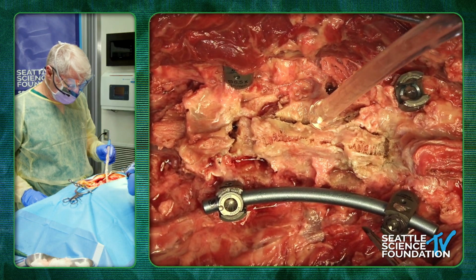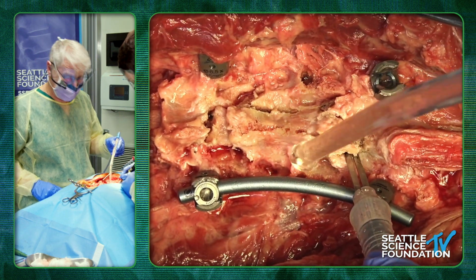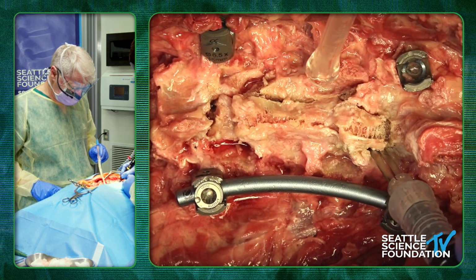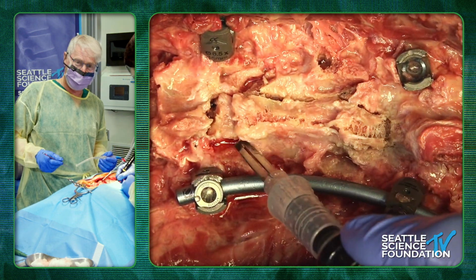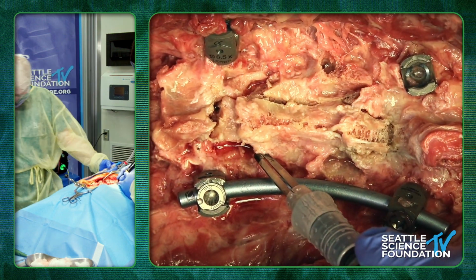So what we're going to do, I don't know if everybody can see, this is L1 that we have exposed here. We have screws in T12 and L2, and we started the decompression. And what we're going to do, he's going to use the Misonix here. It's a really nice cutter, and it cuts just through the bone and spares the soft tissue. So we're going to turn that on right now.